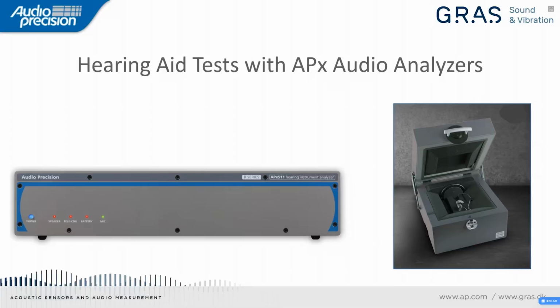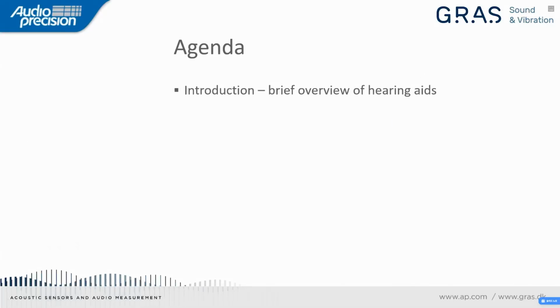All right, we have a lot of material to cover, so I'm just going to jump right into it. First, we'll look at the agenda for today. So I'm going to have a very brief and a very simple introduction overview of hearing aids. And I wanted to mention, I have a fair bit of expertise in audio tests and audio analyzers, especially Audio Precision analyzers, but I am by no means an expert in hearing aids, and if that's what you're expecting today, you may be disappointed. So just to set the expectation.